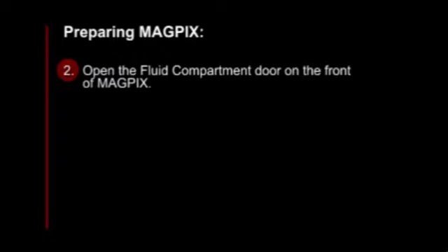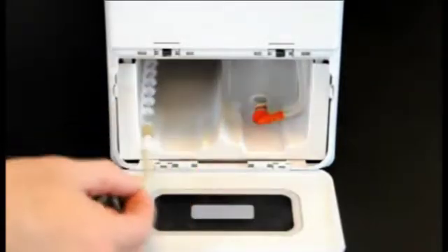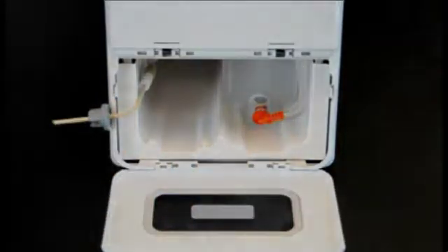Open the carton and remove a container of drive fluid. Open the fluid compartment door on the front of MagPix. On the left side of the fluid compartment, you'll find the drive fluid tube and plug. Pull it forward until it extends outside of the compartment. Place it to the left to allow room to insert the drive fluid container.